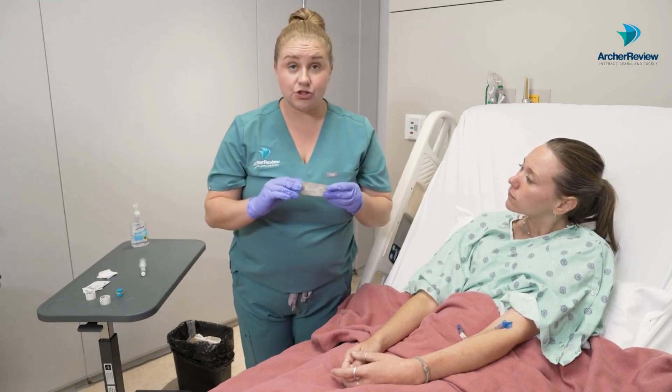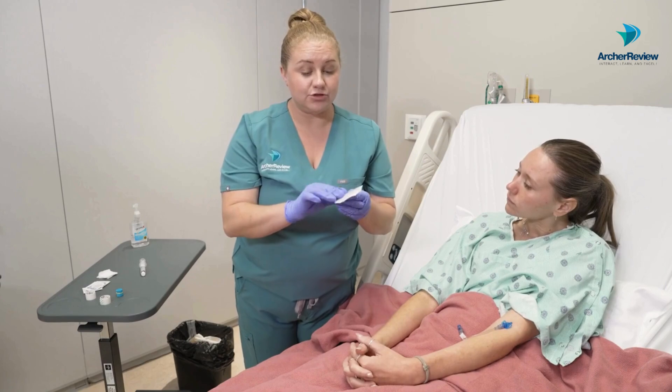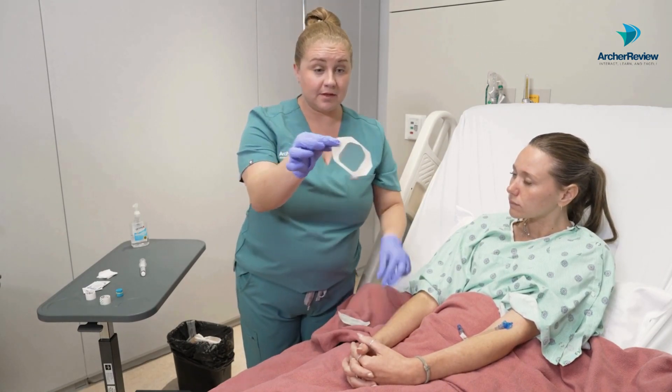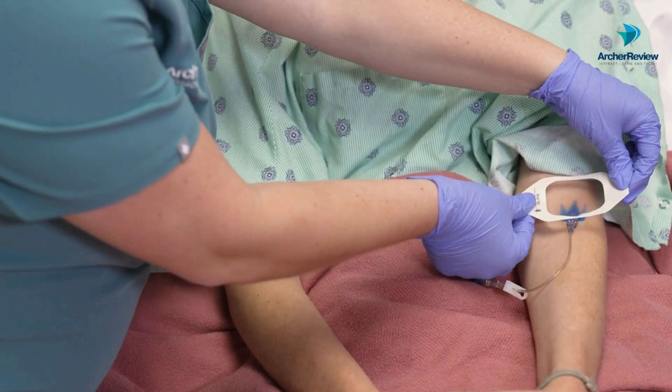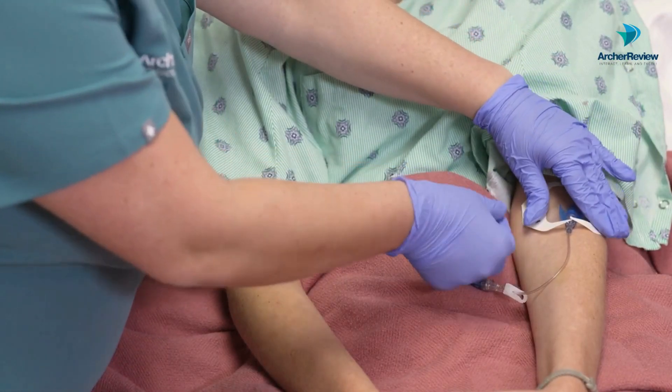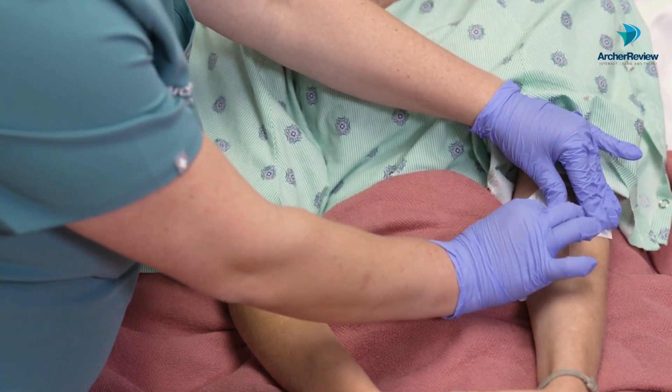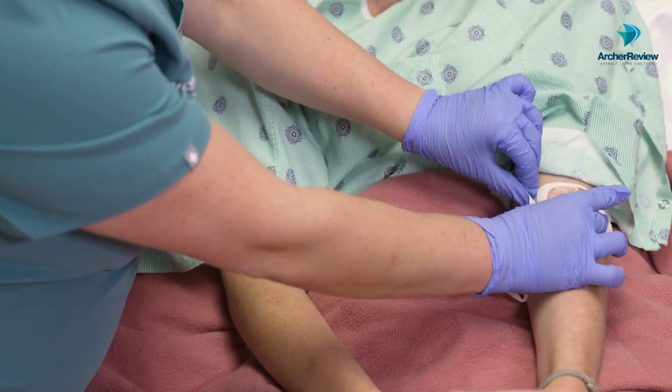As soon as it's dry, grab your new IV dressing. Pull the back off and go ahead and lay it right on that IV catheter. We're going to press down at the edges to make sure we get a good seal.